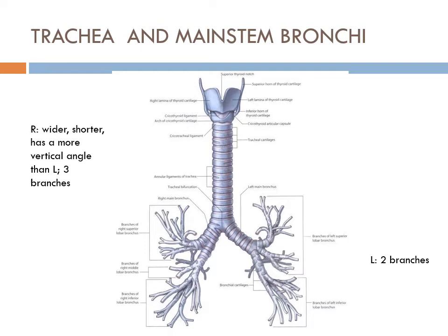So it seems like a textbook thing. Oh, okay, yeah, left is this long, right is that long. But in reality, this is almost always why you start to desat in the middle of the case, because there's been some type of tube movement.